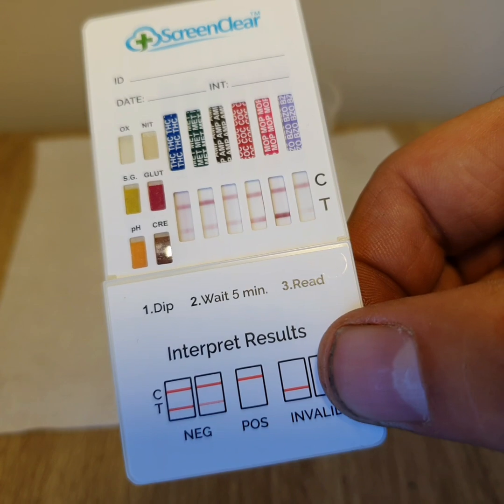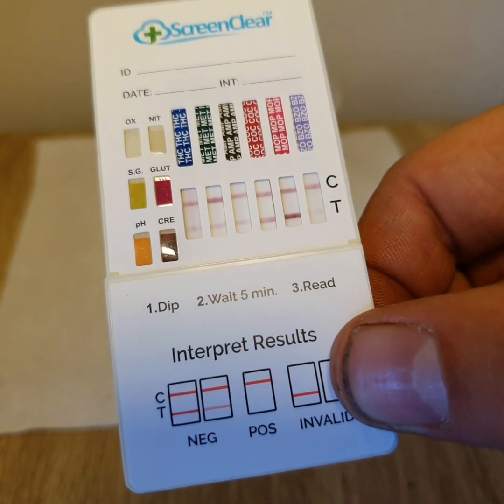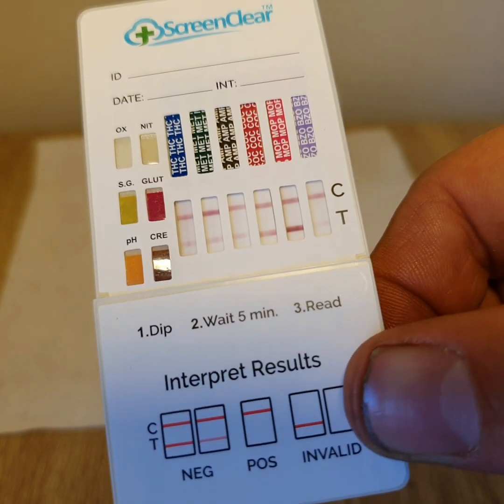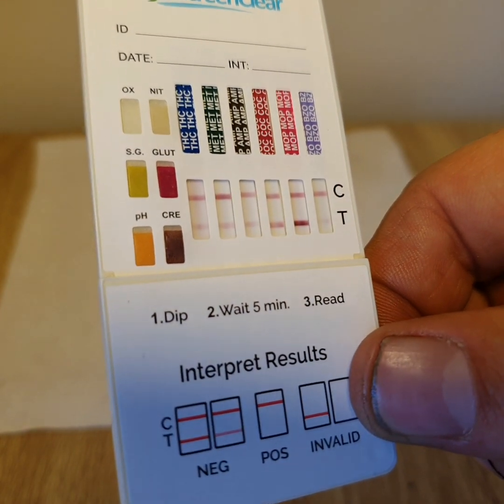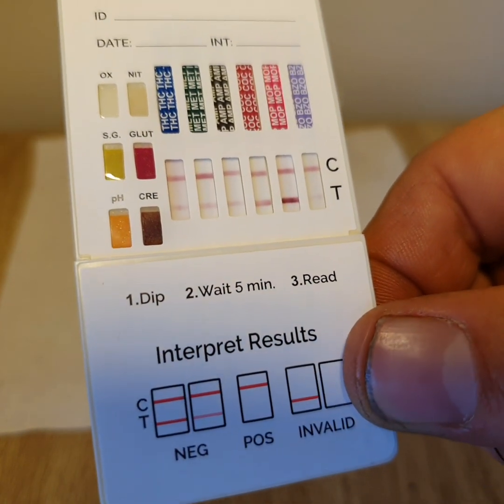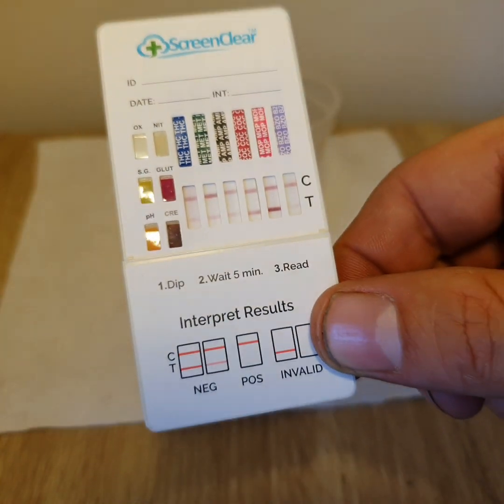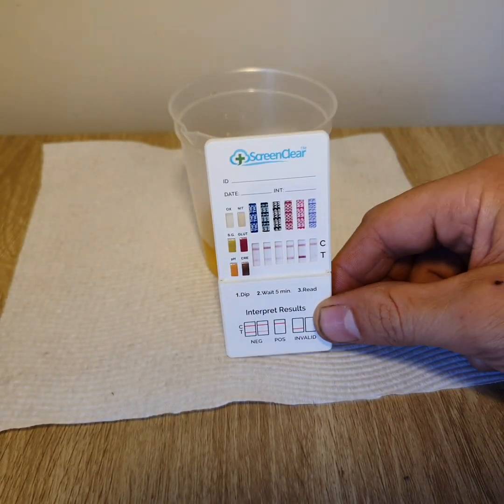So there we go. This is taking about four minutes after the test was started, and you can see two lines in every strip there. The benzodiazepine is definitely a negative result, as you can see a faint line there in the T region. No matter how faint the line is, it's still considered a line and it must be considered negative.